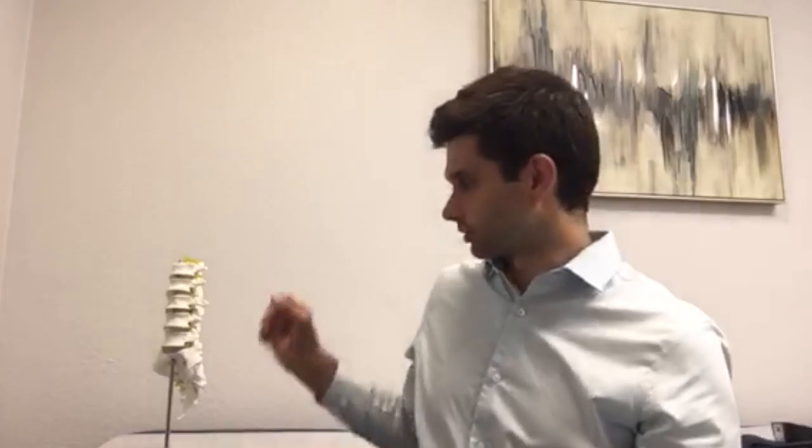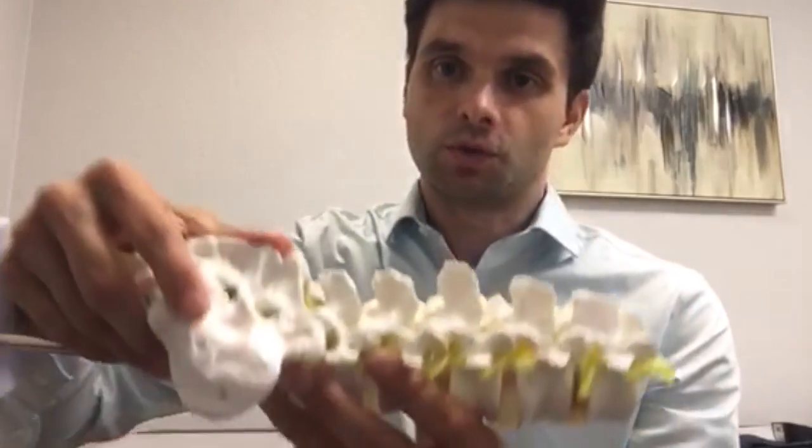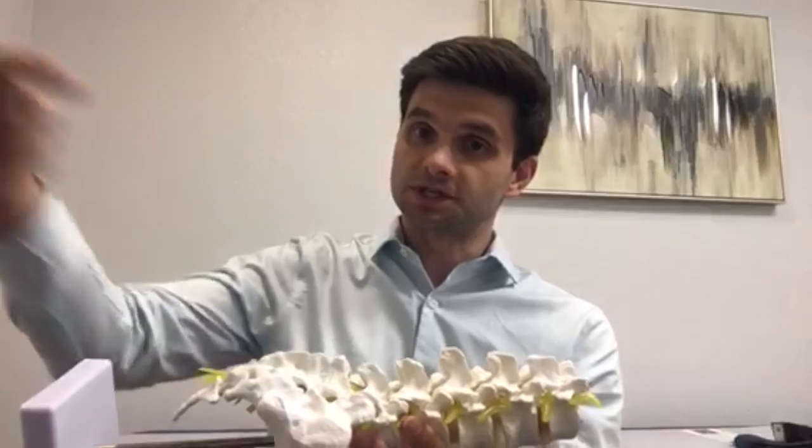Now, the way that spinal cord stimulation works is twofold. There is a trial process and an implantation process. During the trial process, we test to see if this therapy is something that will be beneficial for our patients. It's kind of a try it before you buy it process that we go through. So the trial period, we use needles, very similar to some of the other interventional pain procedures that you may have had, where we place needles through the skin and access the epidural space, place the electrodes in, get them to where we want them using the live x-ray, and then remove the needles, leaving the electrodes in place.